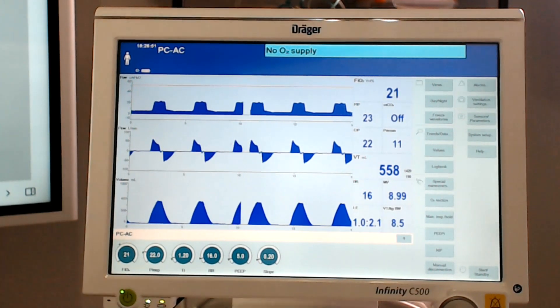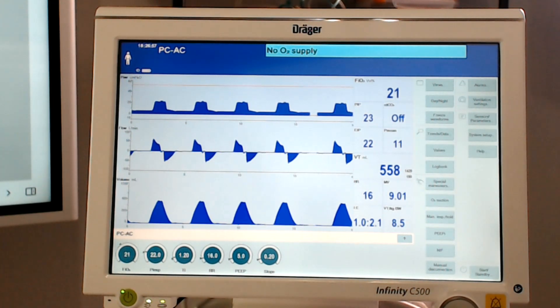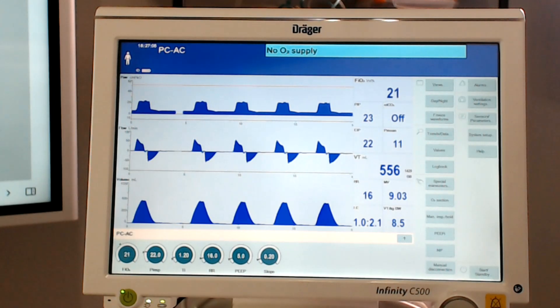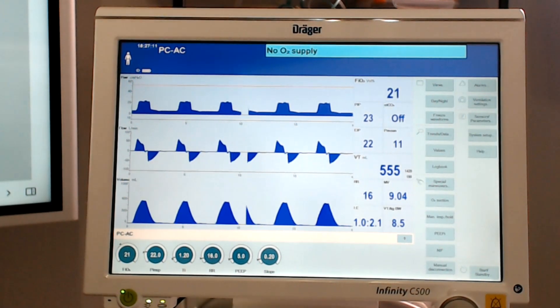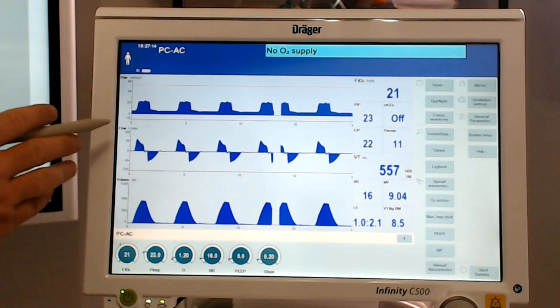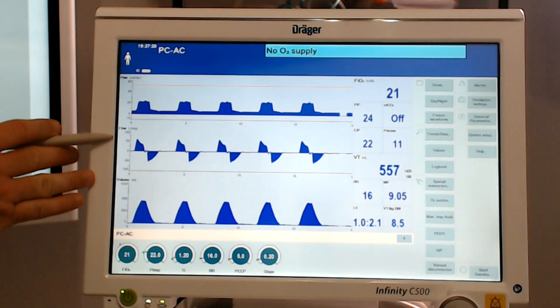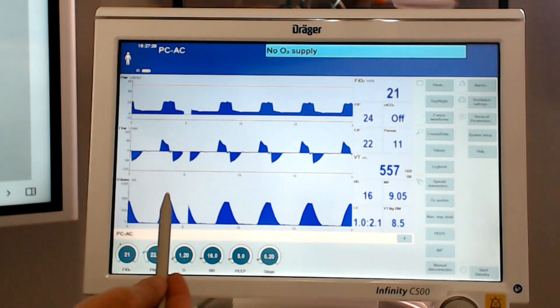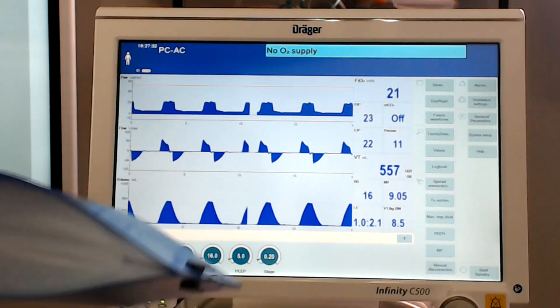Now that's different from volume control. With volume control, we saw a square pattern — and that is 100% one of the flow patterns you will see with volume. But you could also have a decelerating flow pattern with volume control as well. Write this down: in pressure control, you will always have a square pressure waveform, and you will always have a decelerating flow pattern. We see that our volume is now going to be based off of the inspiratory time and the pressure that we have set — notice the difference.